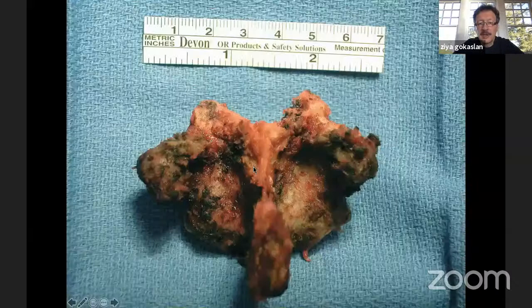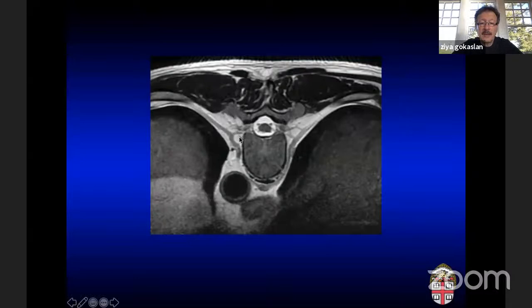And then the next part of the operation is really pretty standard for a lot of the VCRs or vertebral column resections, and this is true for spondylectomy as well. And so we follow this segmental vessel. You can see these vessels are coming off the aorta, and they turn into intercostal vessels. And these are the various tethers from these vessels. There is one nutrient branch that goes into the vertebral body that is a tether that you need to release when you come from posteriorly. Another one is the radicular branch that goes into the nerve root and into the spinal canal through that, and that needs to be released.